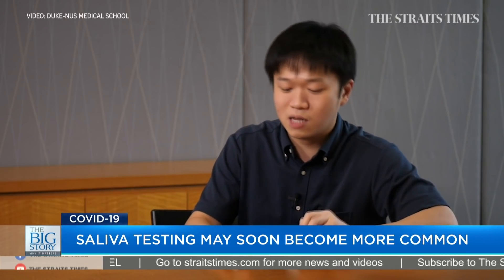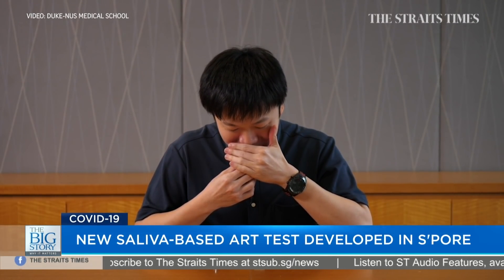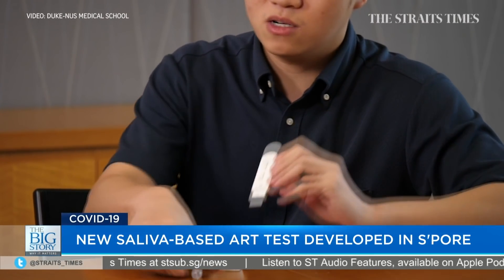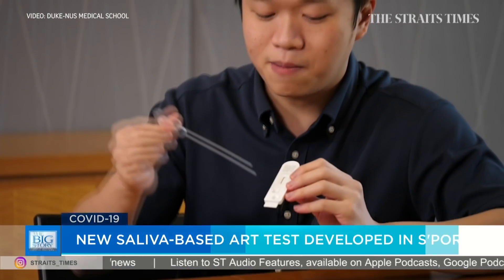The kit comes with a receptacle to collect the saliva. You stop swallowing your saliva for a few minutes, pool the saliva in your mouth, and then put it into the receptacle. After that, use a dropper to take up the liquid part of the saliva and put three drops into channel number one.